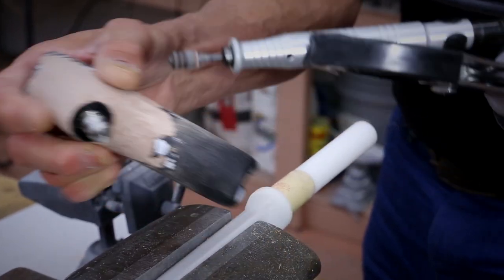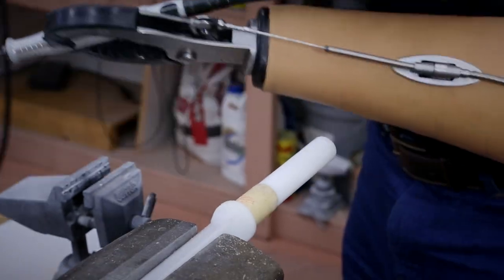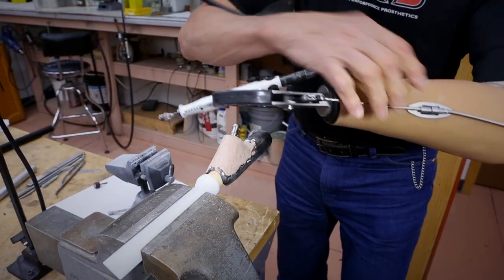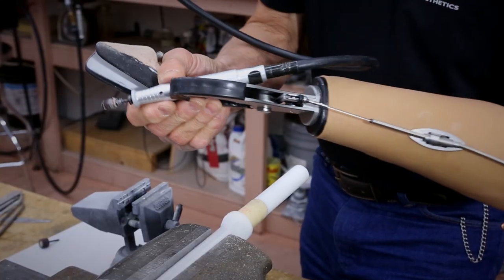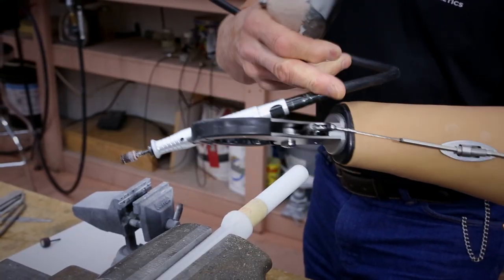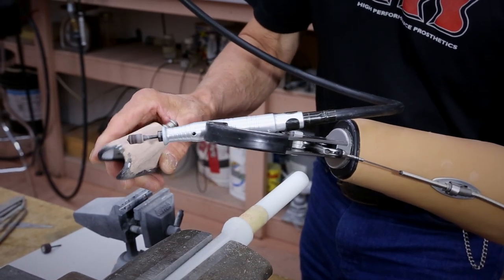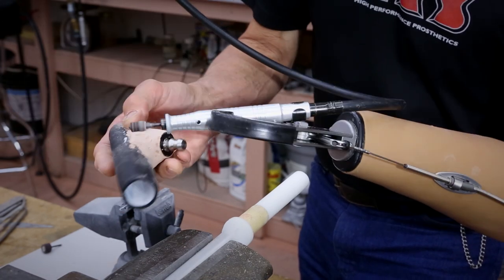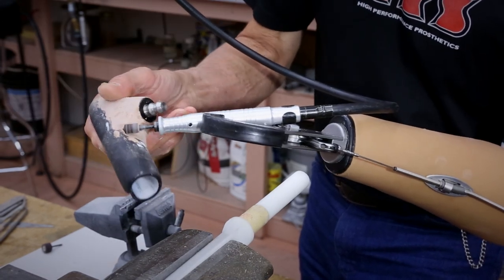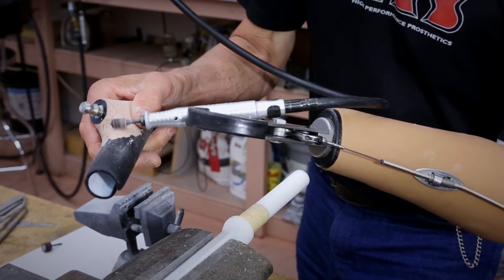I can hold the tool with the terminal device and do some intricate shaping. I can also engage the Sherlock mechanism, and by doing that I've got a grasp on the tool so that I don't have to pay as much attention and don't have to maintain cable tension in the system. So I can do intricate work and use my sound hand to manipulate the pattern to allow me to get at areas that I might not otherwise be able to reach.